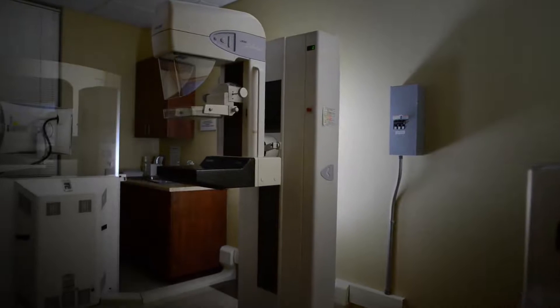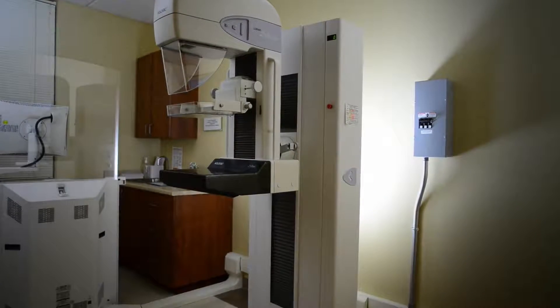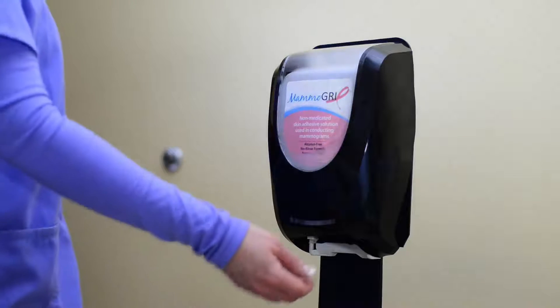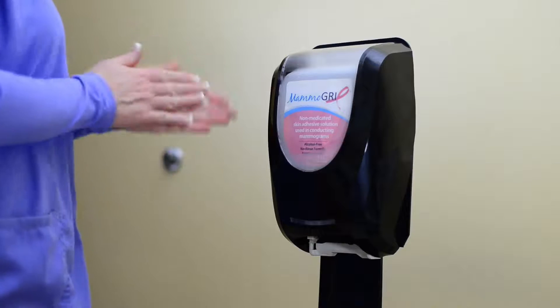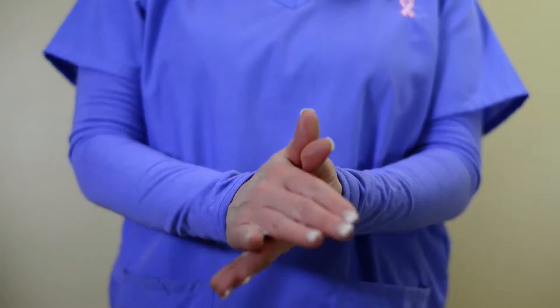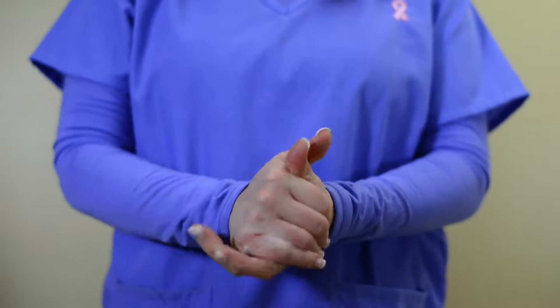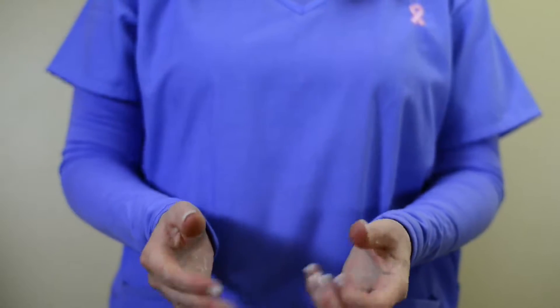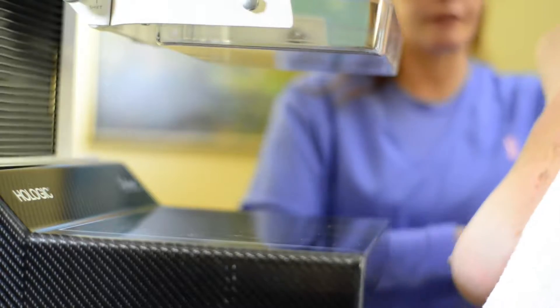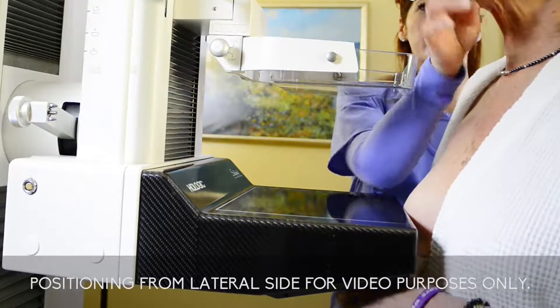With Mammogrip, you use the same positioning techniques you already know. But first, place one pump of Mammogrip foam into the palm of your hand and rub your hands together. As the foaming solution starts to dry, it creates a slightly tacky feeling. While Mammogrip starts drying, remove the sleeve from one side of the patient's shoulder.